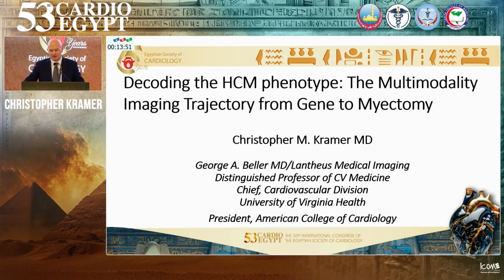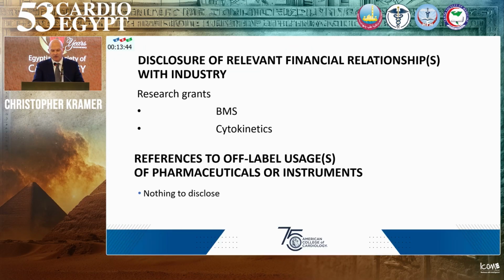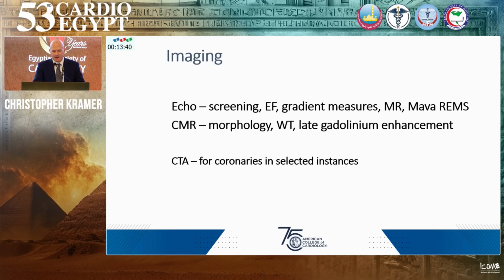So, Dr. Moharram discussed early HCM, identifying preclinical HCM. I'm going to focus more on the overt disease. These are my disclosures. So I'm going to be focusing on both echo and CMR.